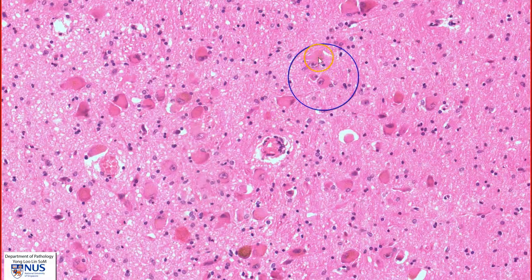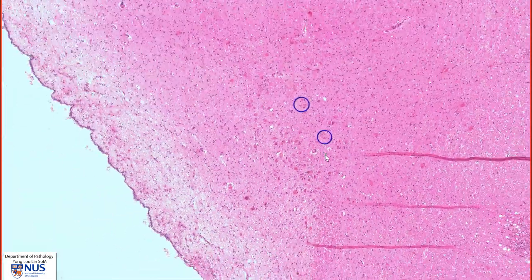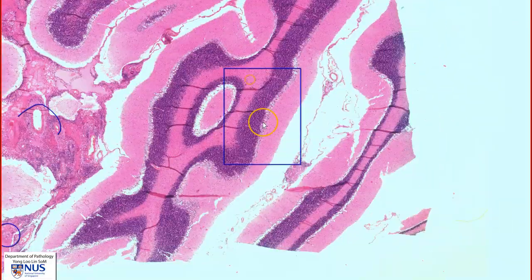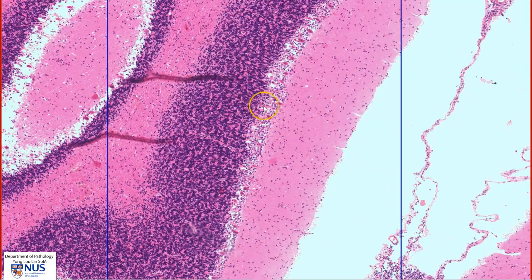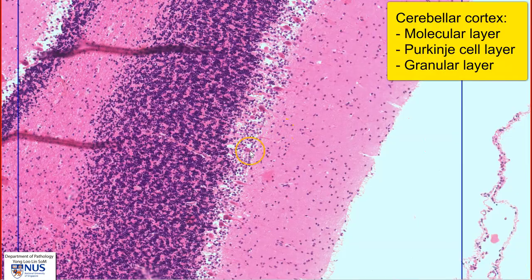Here again we can see some neurons. Moving on to the cerebellum — the cerebellar cortex is composed of three layers: the molecular layer, the Purkinje cell layer, where we can see very large neurons, and the very cellular blue-appearing granular layer.